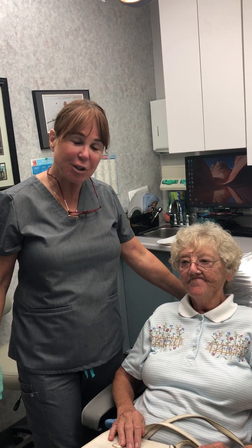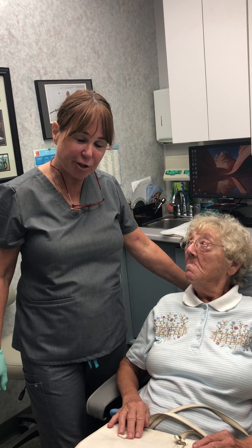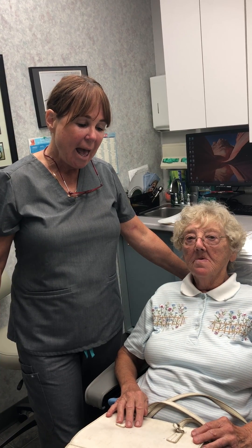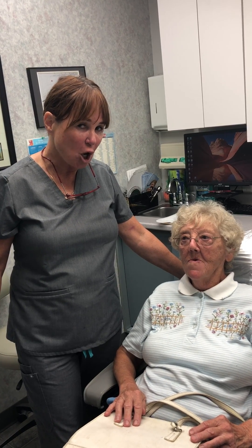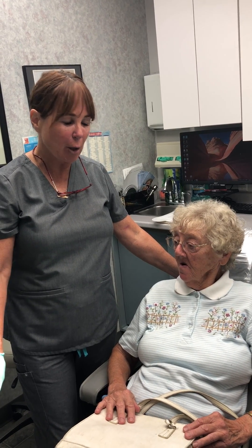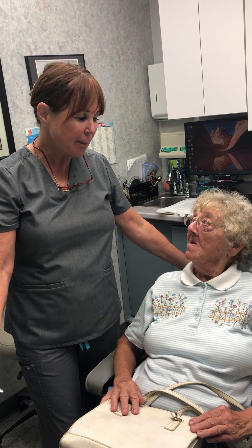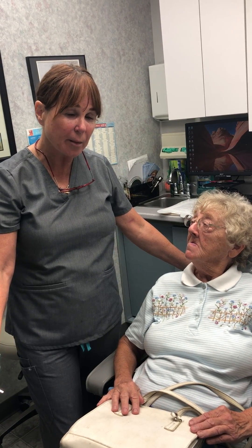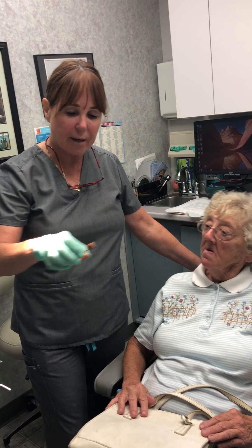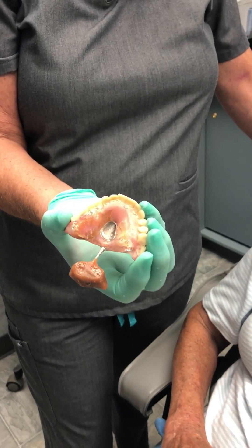Good morning. This is my patient Barbara. She's been a patient of mine for 15 years now and she was born with a cleft palate and has a difficult time talking without her obturator. I made her an obturator 14 years ago and today she was telling me what she thinks of it. First, I'm going to have her speak to you without the obturator in. Now, an obturator is an upper denture with a portion of it that replaces the palate that is no longer there.